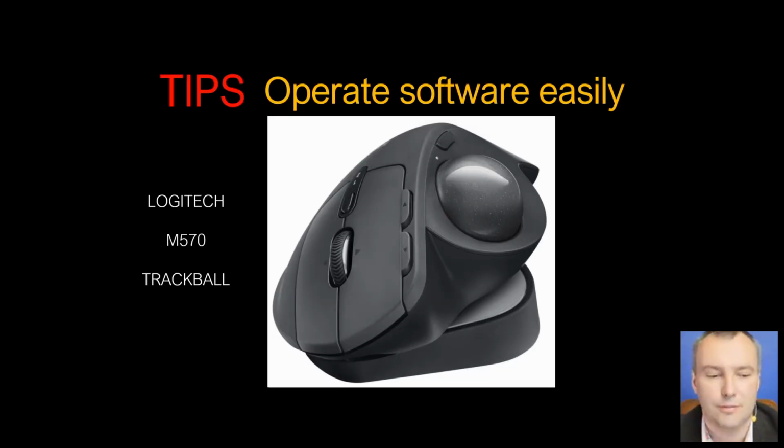So, first of all, you need to operate the software very easily near your dental chair. The best solution that I'm actually using right now is a trackball device. It's not a typical mouse, because for a mouse you need a lot of space near the dental chair. It's a trackball where you just move only this one. It's very easy. Only one company is producing them now, Logitech. So this is very useful for any software navigation on the screen.